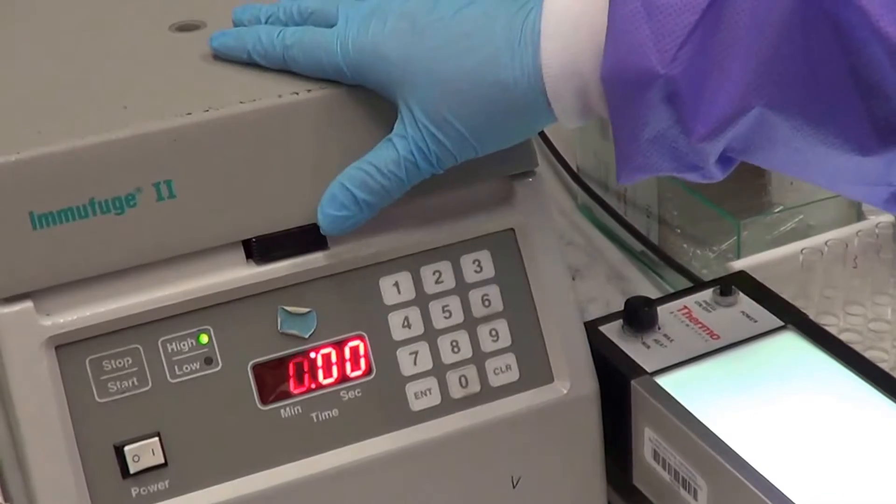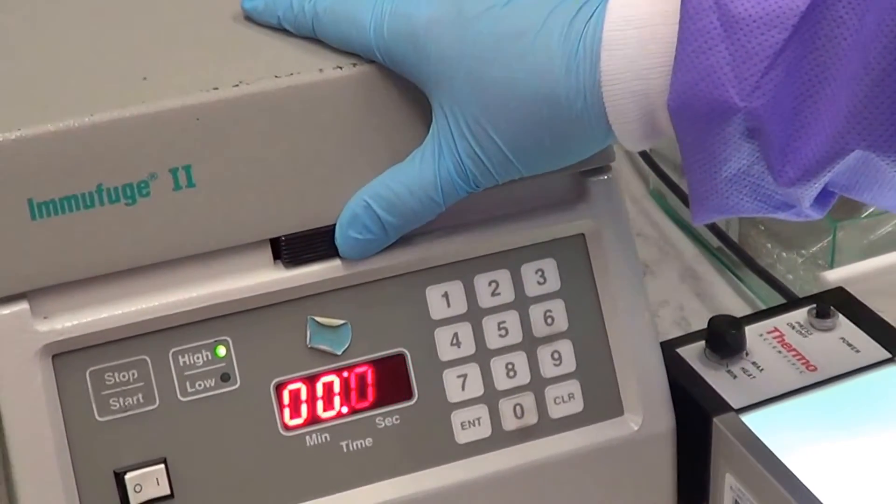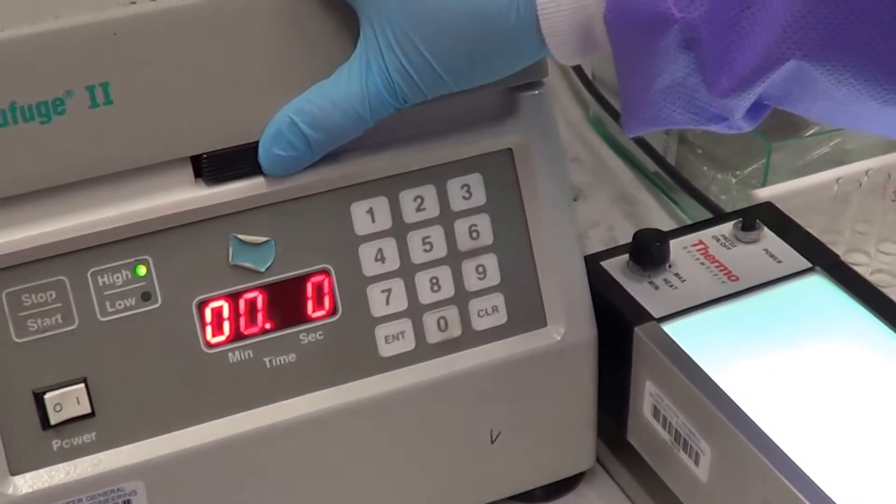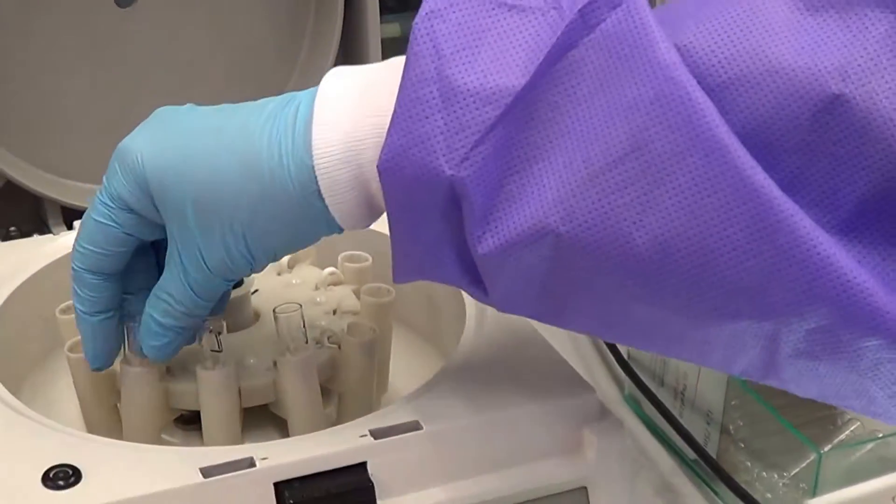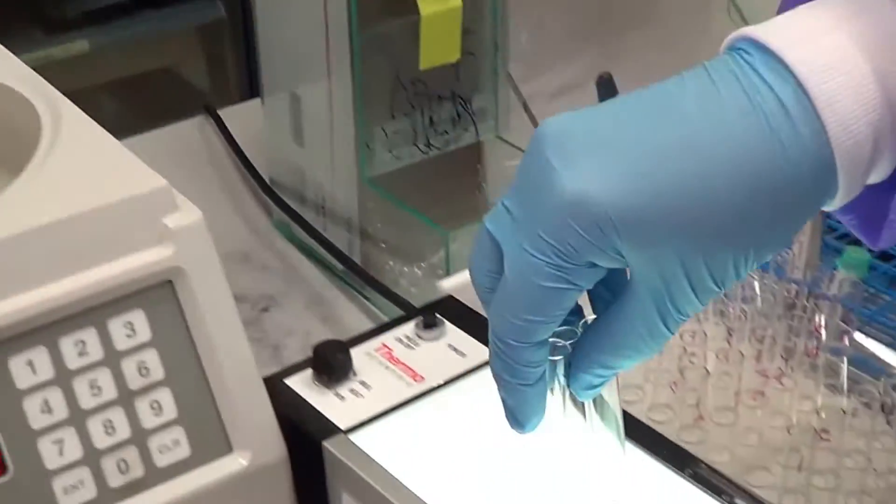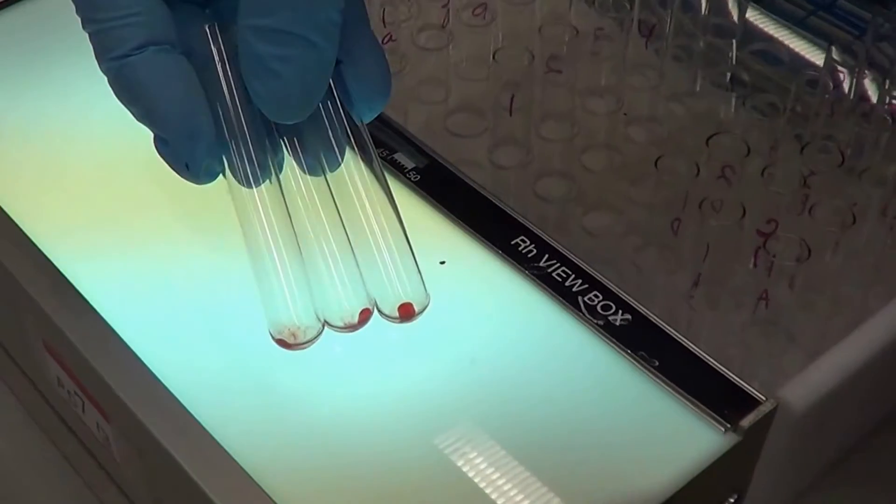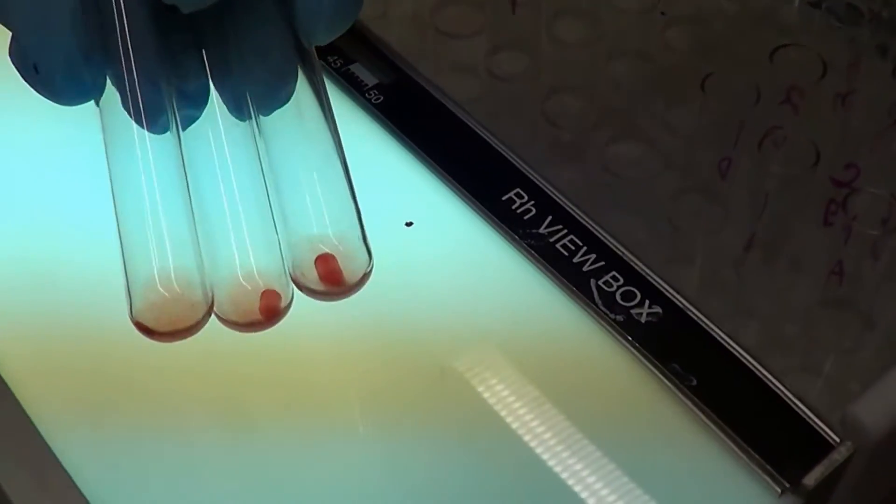Remove the test tubes from the centrifuge and we are going to re-suspend the cell button looking for agglutination. Just hold them so I can see the cell button. Now you gently re-suspend looking for agglutination.